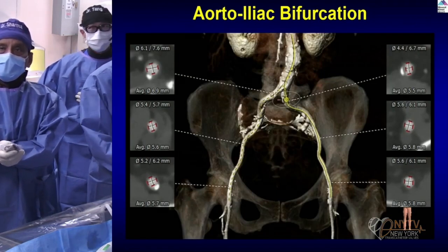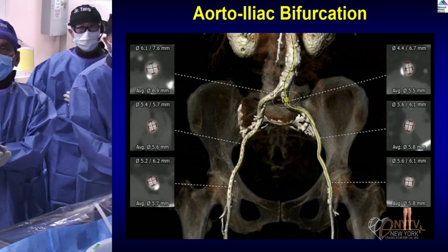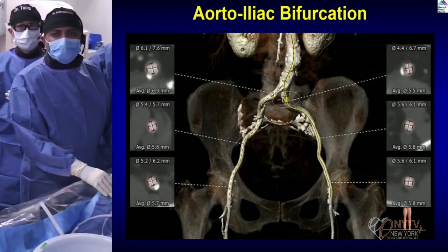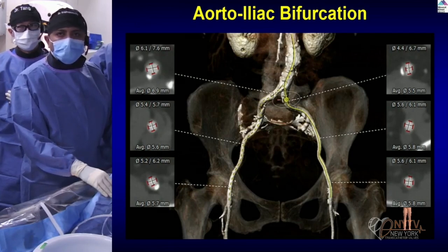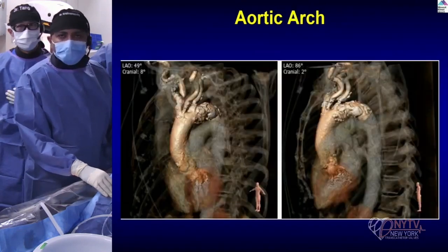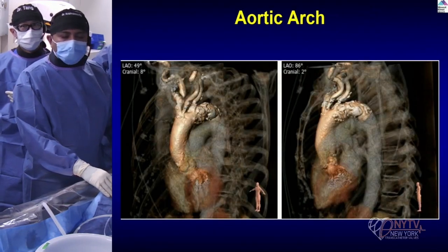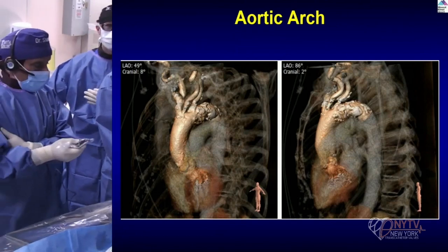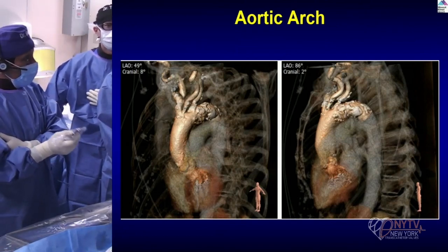Sure. Calcified posterior wall, but otherwise there's no calcium on the anterior wall. We used the right side as the main access. Ultrasound was used for obtaining access, and there was no trouble. We did two pre-closes. I know Samir said that they use one pre-close only and sometimes put an Angio-Seal. We are still routinely using 2 pre-closes, correct?